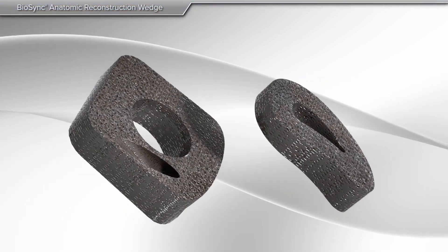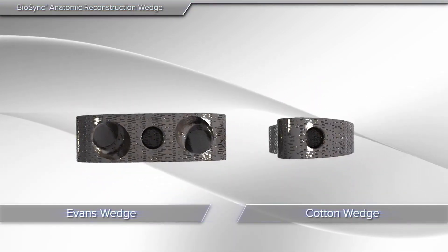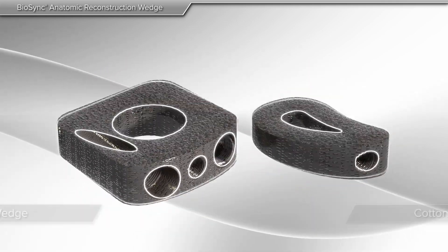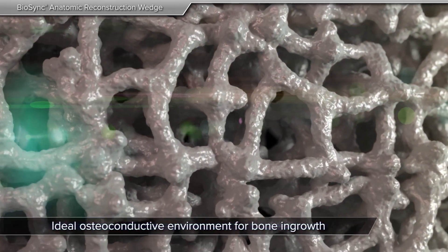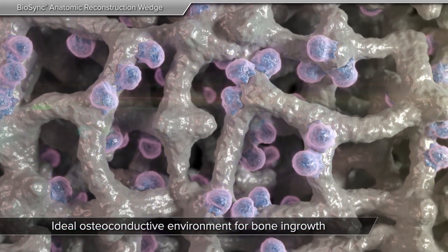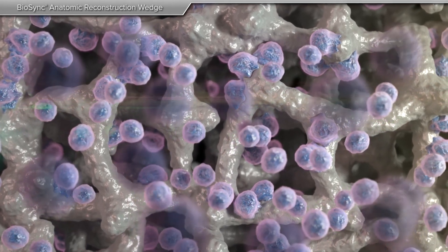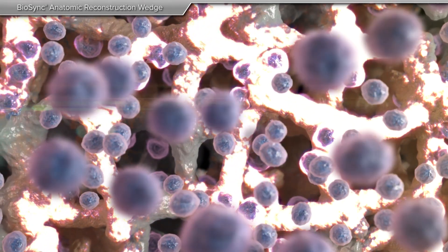Biosync anatomic reconstructive wedges provide an alternative to donor bone, most commonly for Evans and cotton procedures performed for realignment of the foot. Biosync wedges are three-dimensional titanium scaffolds that allow for bone and tissue ingrowth. Biosync technology can enhance both growth and healing, as well as add support for the realigned bones.